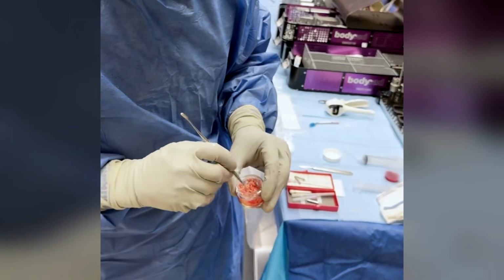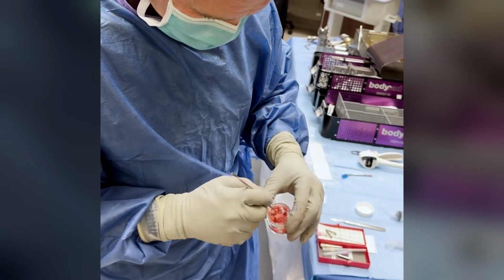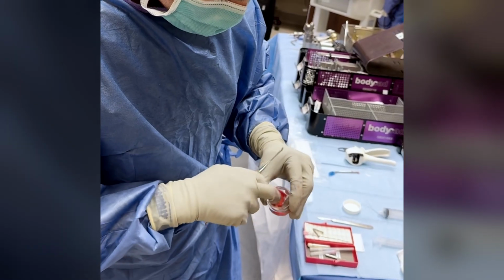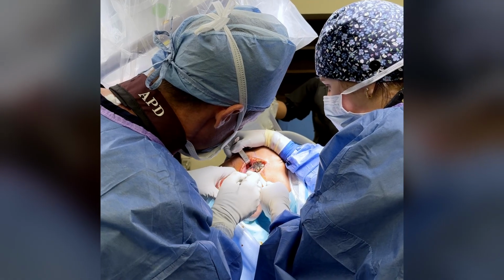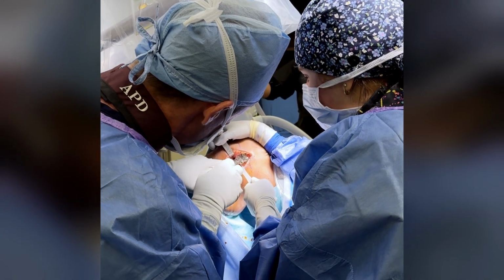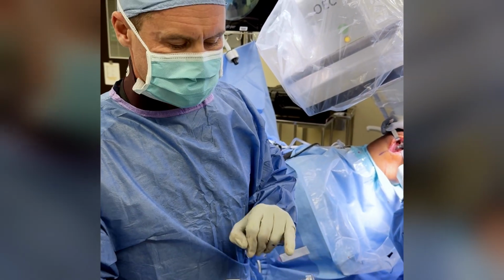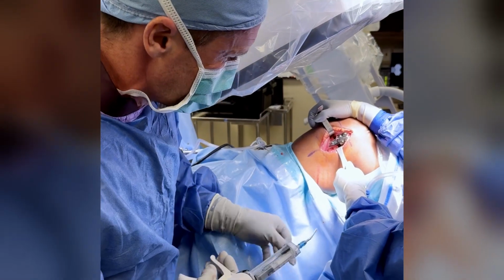And this is what we're gonna use to fill in that osteotomy to develop new bone. You see that there. There you go, it's bone graft. Finally, a combination of calcium sulfate, calcium phosphate bone cement. So that's gonna go into the osteotomy here with our applicator.